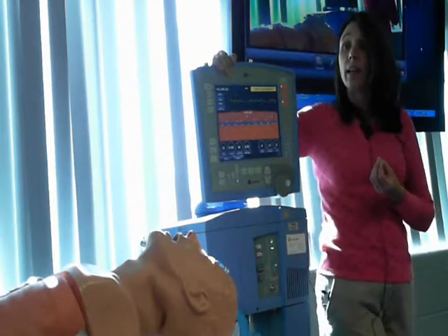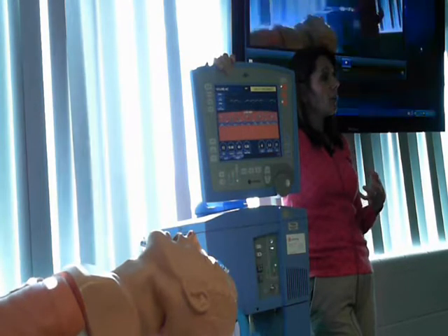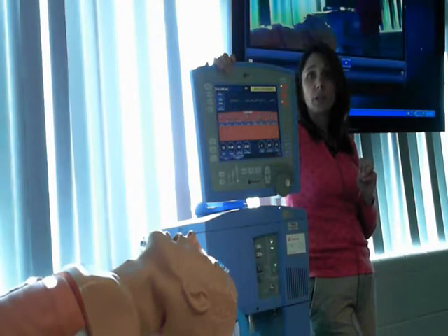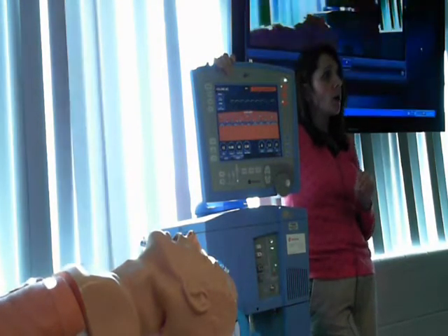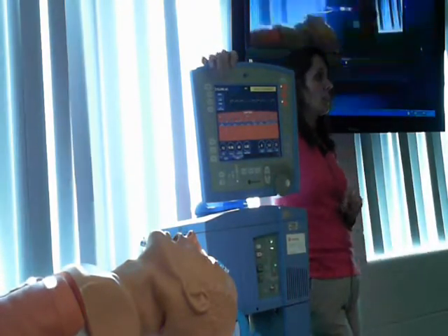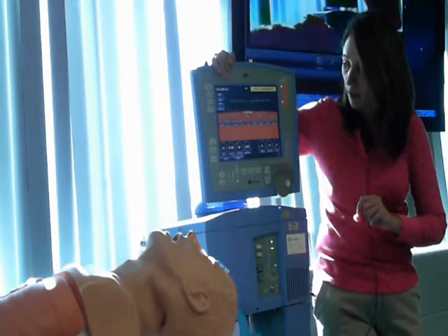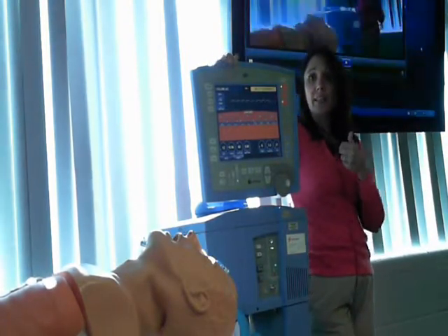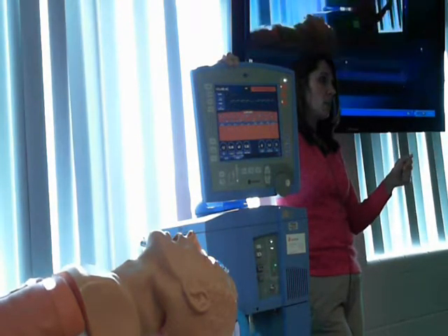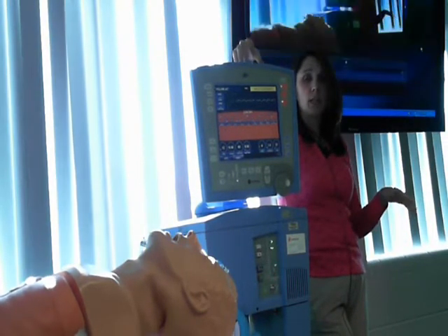And what you need to know is that if you are ever in question as to your patient's ability to sustain their own respiratory rate and tidal volume, use full ventilatory support. And the mode you will most commonly see for full ventilatory support is assist control. It's written on this vent as AC. Okay? AC guarantees that every single breath, my patient is going to get the tidal volume that I say they should get, and they're going to get the number of breaths that I say they can get. So if they become apneic, not a problem. This vent's in complete control.